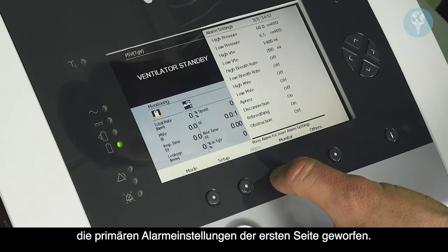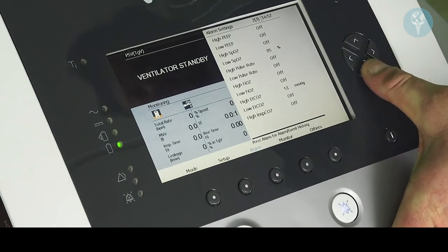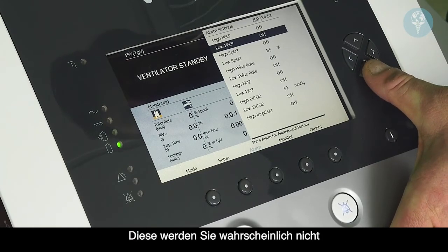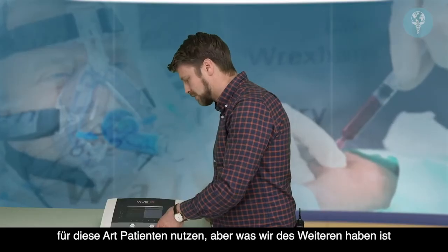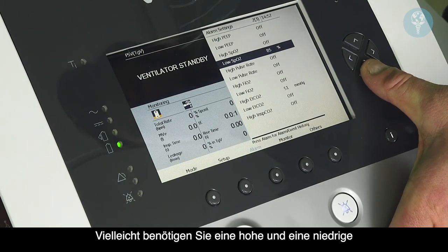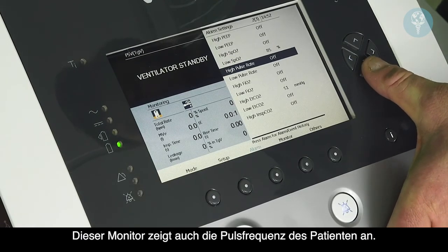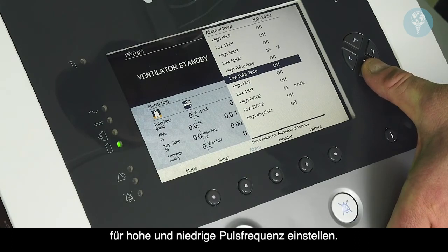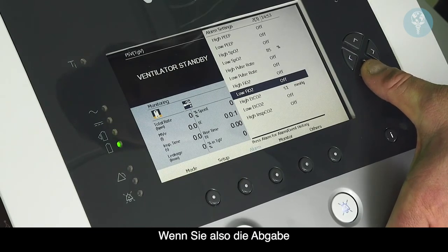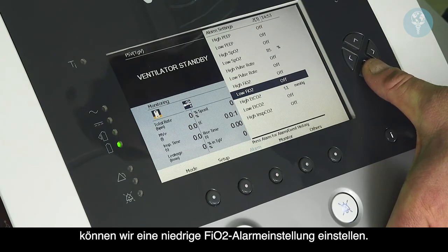We've had a look at the primary alarm settings on the first page, so let's look at what we've got on the second page of the alarms. As I go down through this list, I have a high and low PEEP alarm. You probably won't be setting this for these patients, but we do have the accessories for the SpO2 monitor, so you may wish to set a high and low SpO2 alarm setting if required. That monitor will also look at the patient's pulse rate, so you can set a high and low pulse rate alarm if needed. We will be using FiO2 monitoring as well, so if you want to guarantee at least a set delivered fraction of oxygen, we can set a low FiO2 alarm setting there.